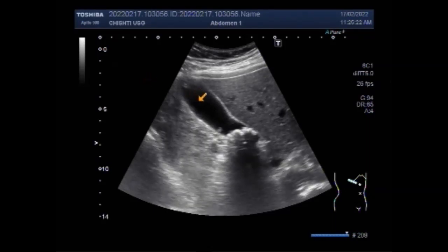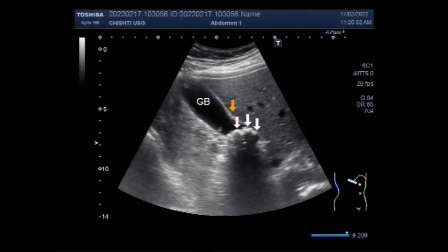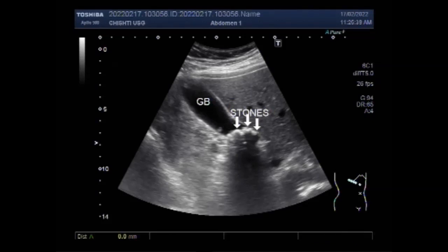You can see this is the gallbladder. These are the multiple stones seen in the neck of the gallbladder, and multiple gallbladder polyps are seen — as you will see later on in this video — along the interior and posterior walls of the gallbladder. Now you can see the multiple stones collectively measuring about 26.8 mm.